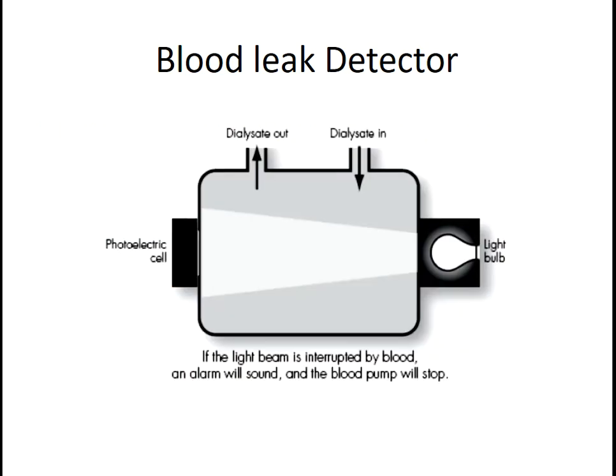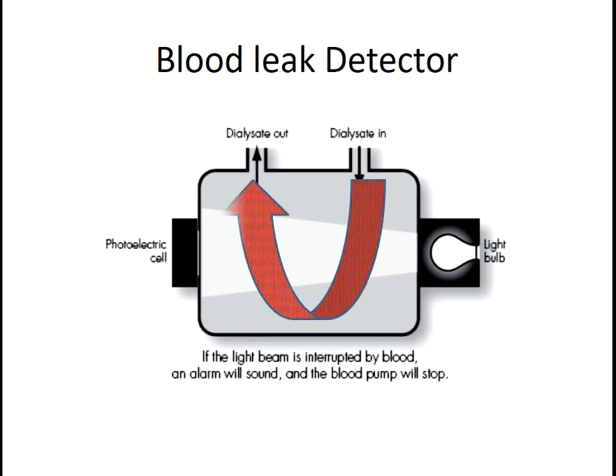And photoelectric cells, while dialysate is flowing, if red blood cells are found, it will initiate the alarm.